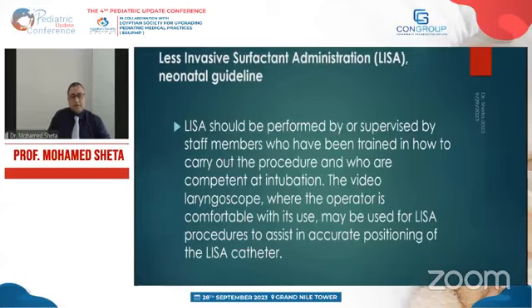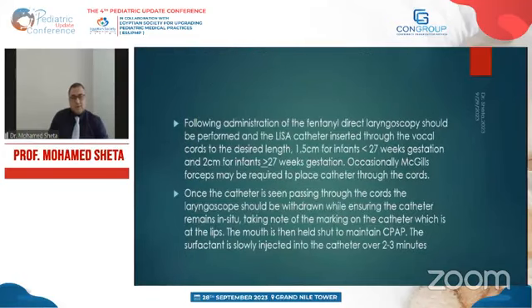Less invasive surfactant administration, LISA, this is from the neonatal guidelines. It should be performed or supervised by staff members who have been trained in how to carry out the procedure and who are competent at intubation. The video laryngoscope may be used for the LISA procedure where the operator is comfortable with it, to assist with accurate positioning.